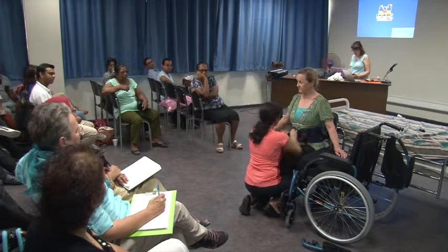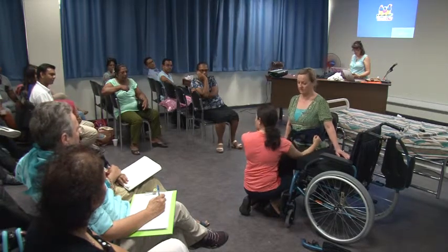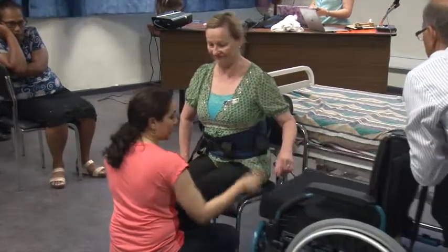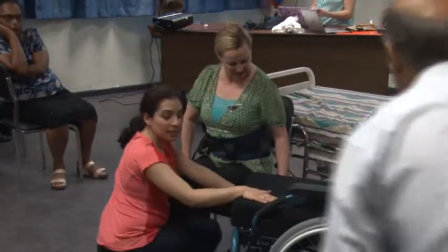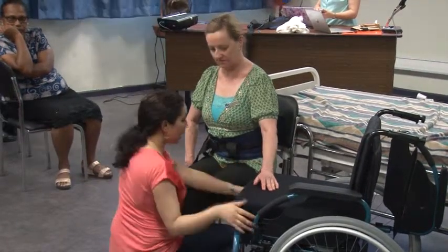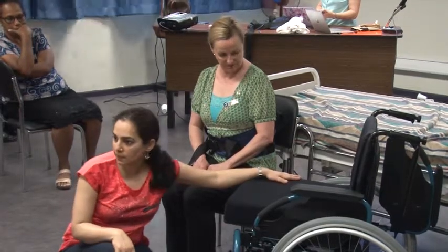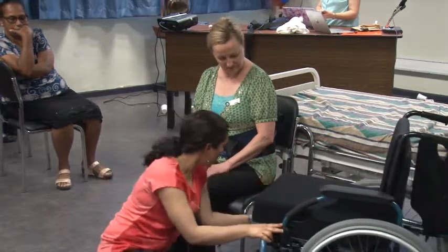Lift it. Okay. I've got the loops to hold her. Remember, she's got good trunk. She's got some ability in her legs as well, but not strong enough to give herself a big lift. All I'm doing is guiding her without pulling on her. I want to keep the other surface she's going to at a minimum distance, so I don't have to do too much, right? And I want to keep the obstructions away. So that's why I took everything that could come in my way away. Foot plate has gone, armrest has gone. Definitely put the brakes on. Safety first. So let's get the position right.